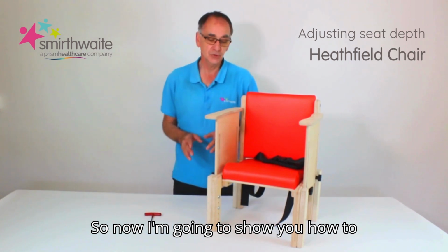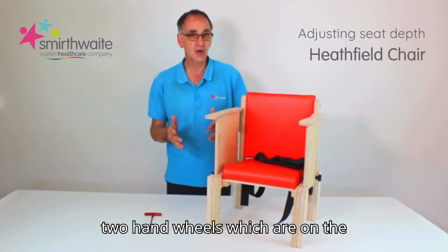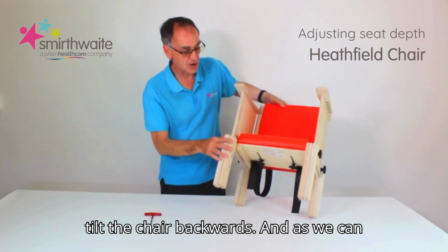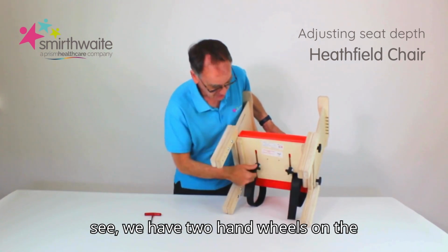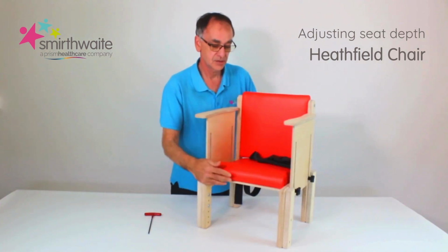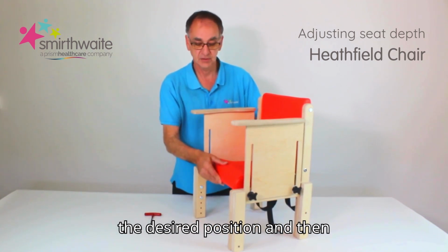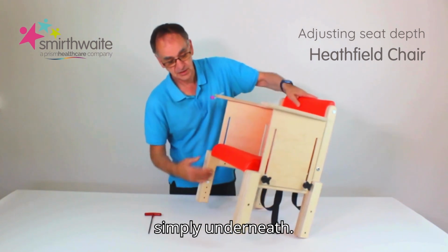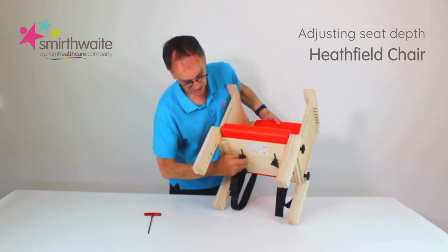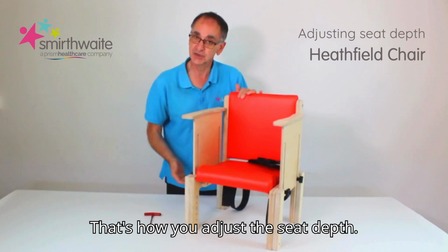So now I'm going to show you how to adjust the seat depth. The seat depth is adjusted simply by two hand wheels which are on the underside of the chair. So for demonstration purposes, I'm just going to tilt the chair backwards, and as we can see, we have two hand wheels on the bottom. These need to be loosened, and then the depth can move backwards and forwards to the desired position, and then simply underneath tighten the hand wheels up. Again, I've just done one there, but so you can see, tighten the second hand wheel, and that's how you adjust the seat depth.